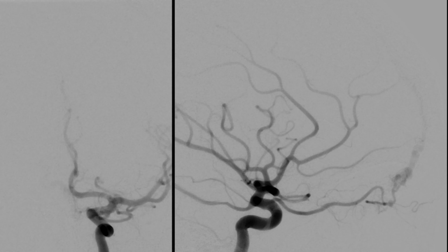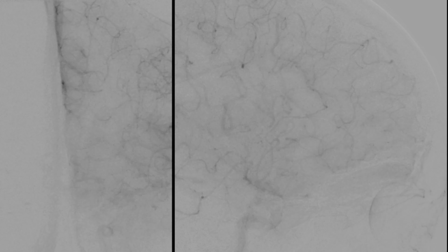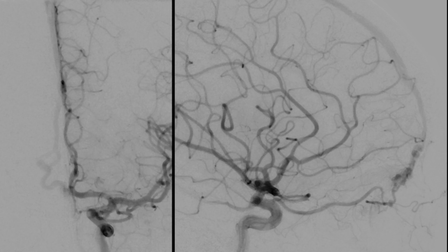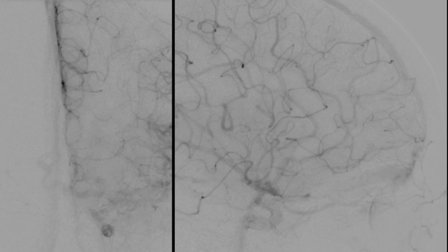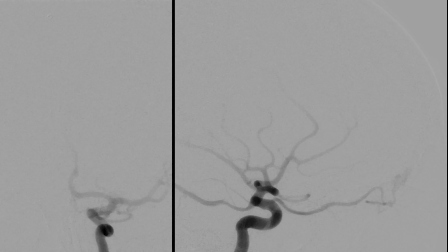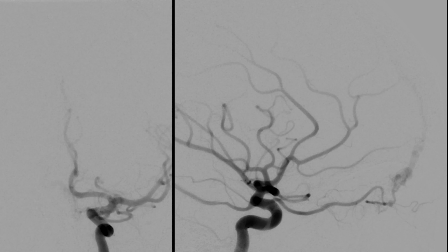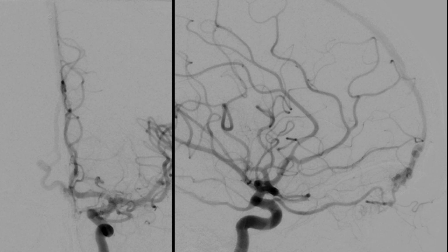Then we can see the first angiograms, and again you can see nicely the ethmoidal AV fistula and the drainage in the cortical vein. So that's a high-grade fistula that has a bleeding risk, and that's why we treated it. We placed the guide catheter in the proximal part of the superior sagittal sinus.